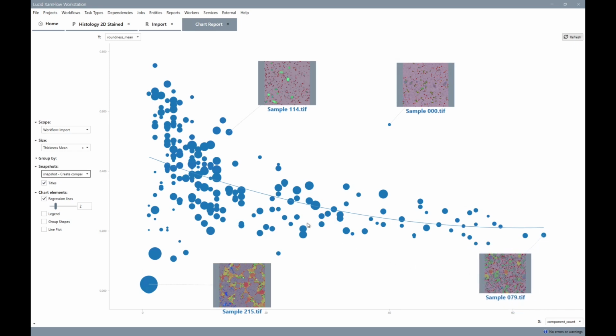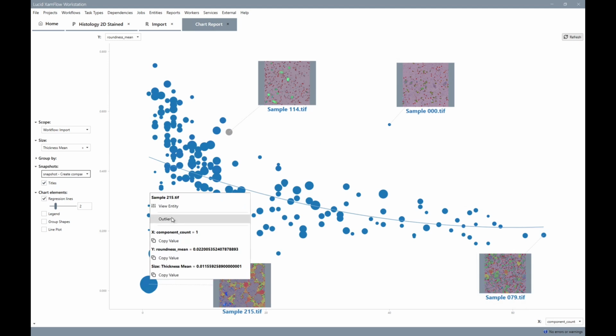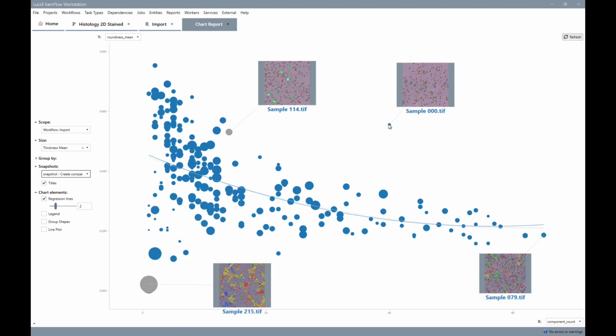Similar workflows can be used, for example, for histopathology studies, histomorphometry of histological sections, with staining agents that selectively color different cell types or components, but also, for example, for petrographic thin sections, and more.